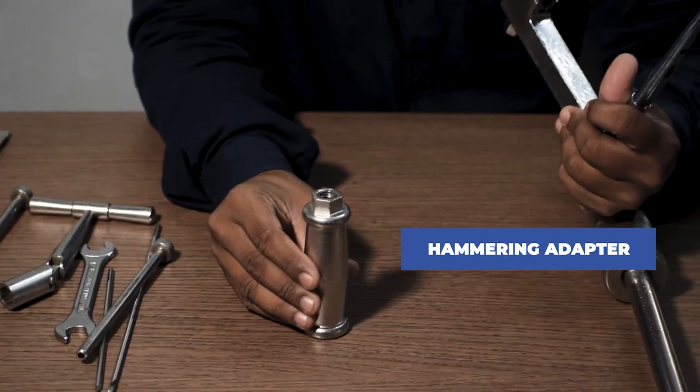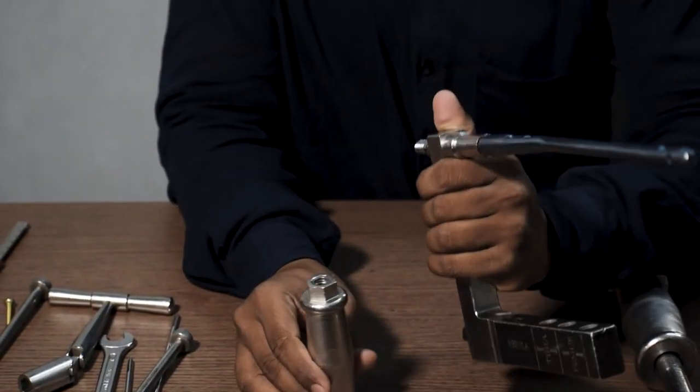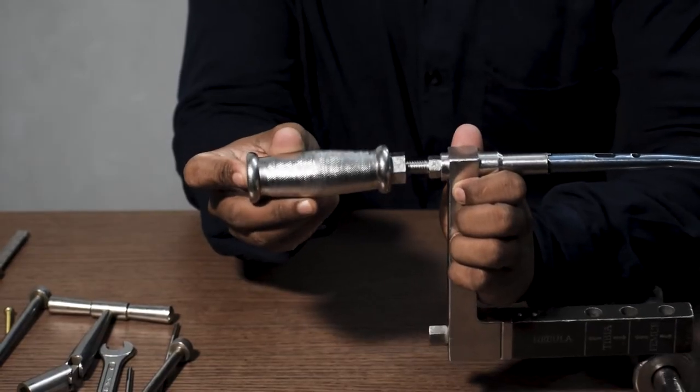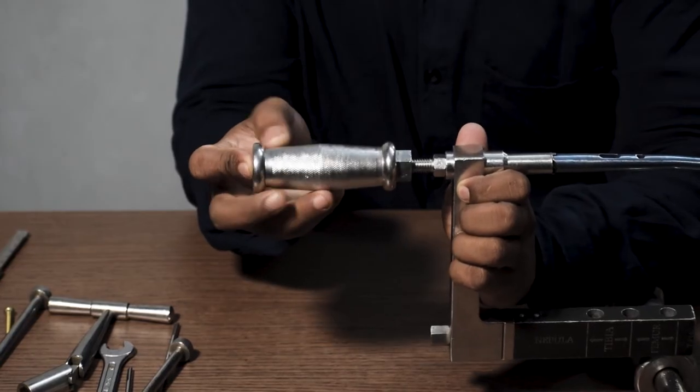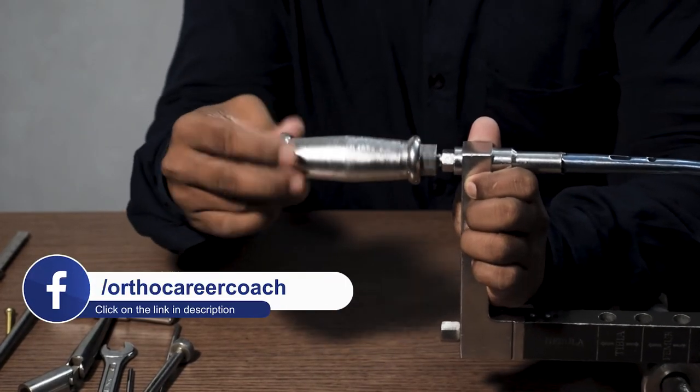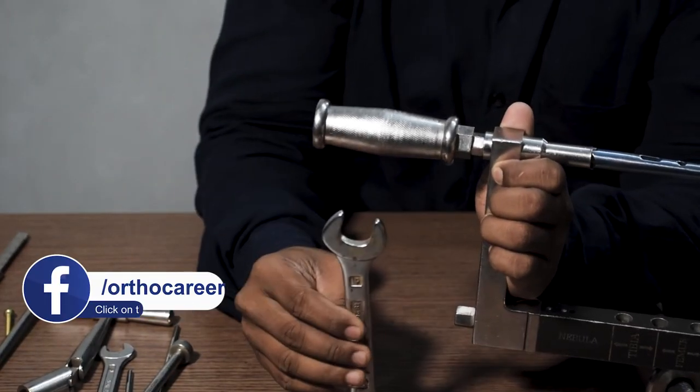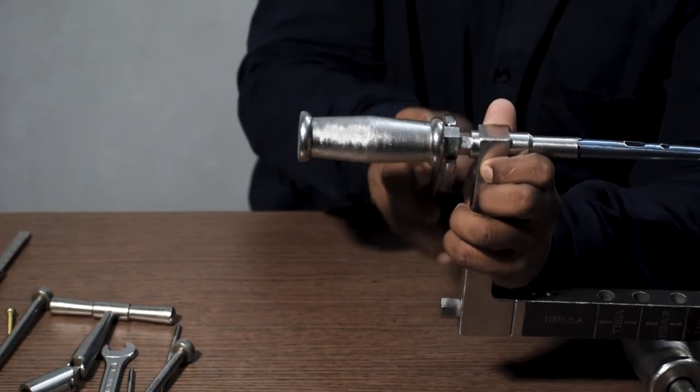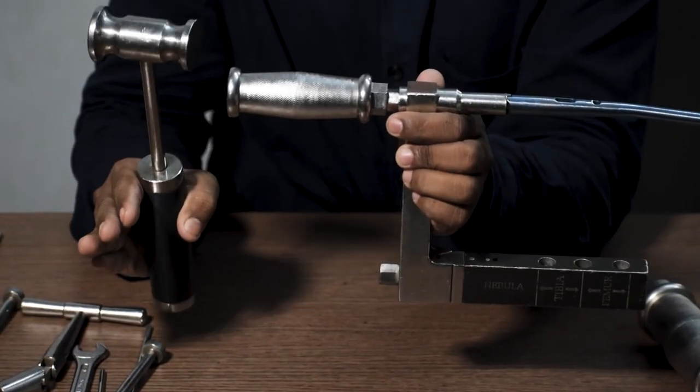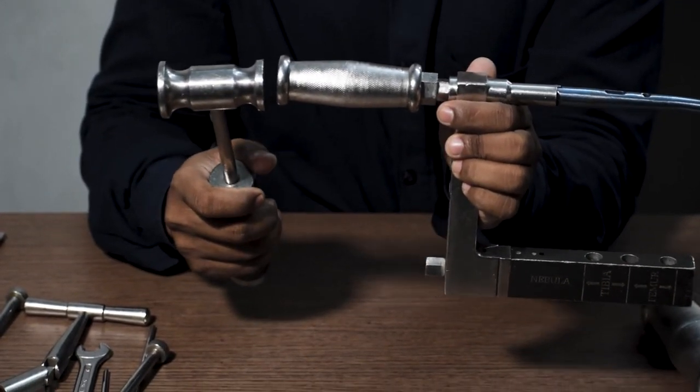This is a hammering adapter. This is used to do the hammering. This gets attached in the conical bolt of the jig like this, and further tightened and locked with the help of a spanner. During the entry of the nail in the medullary canal, gentle hammering like this.